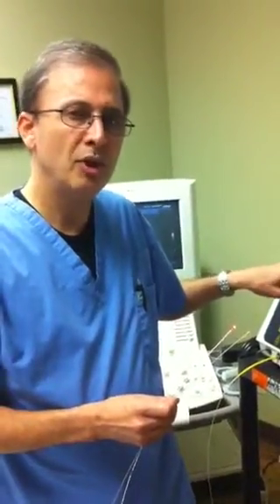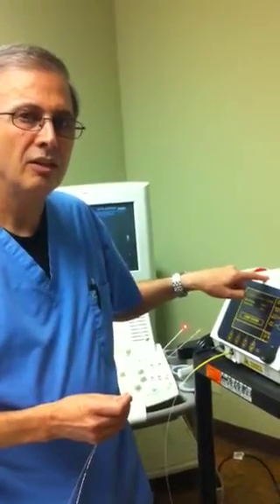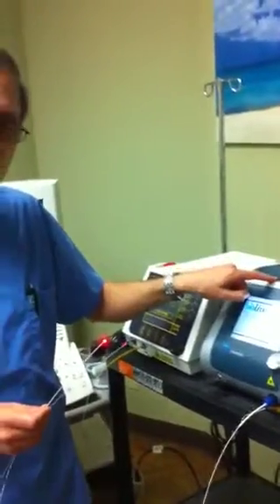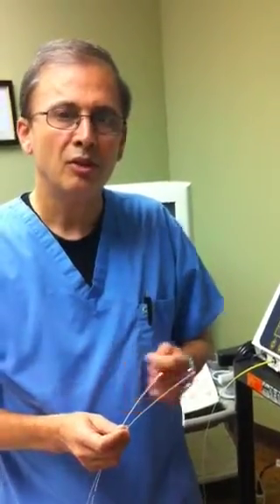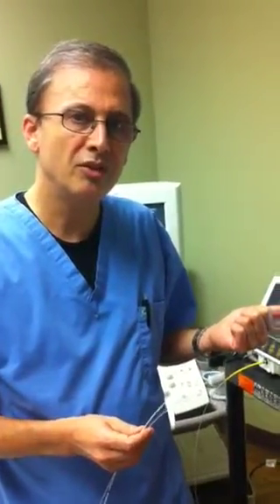One thing we can use is just very low power with the new technology versus the rather high power. We had to use about 14 to 15 watts of energy for the former system, and now we can use about 5 watts. That results in the patient not having much pain after the treatment, as compared with the former treatment method and all other existing endovenous laser ablation systems.